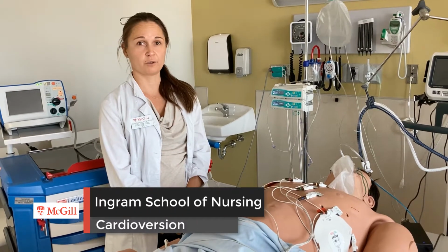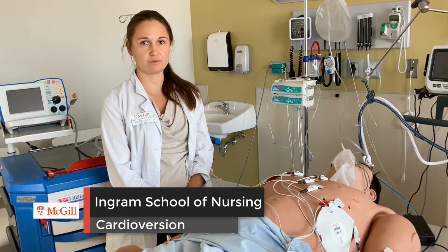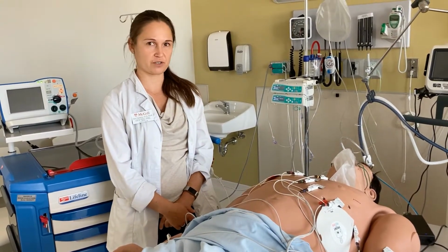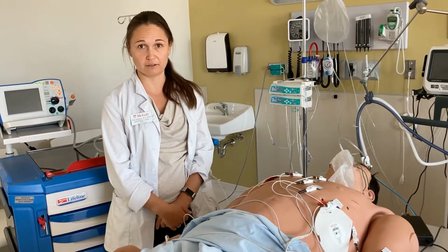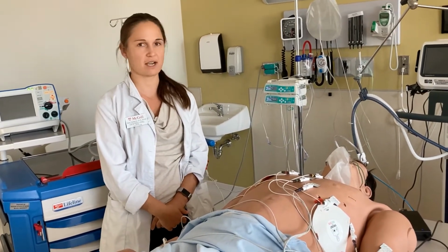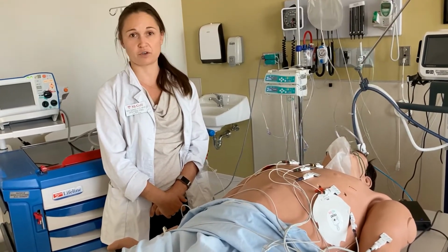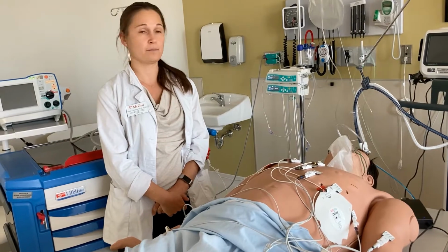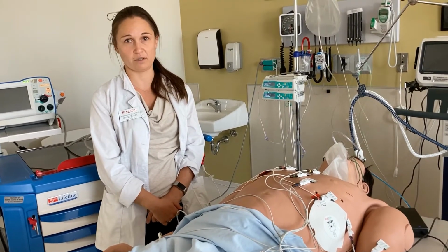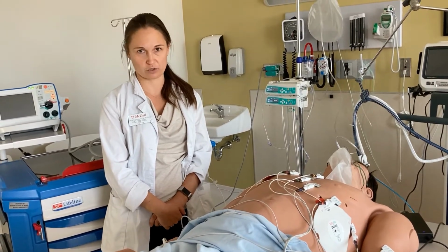Now we will talk about cardioversion. As you recall, cardioversion is an intervention that's very different from defibrillation because it is not meant to address a life-threatening lethal rhythm such as a ventricular fibrillation or pulseless ventricular tachycardia. Cardioversion is meant to reverse a rhythm that makes your patient present with signs of shock and hemodynamic instability, and that cannot wait for pharmacological treatment.